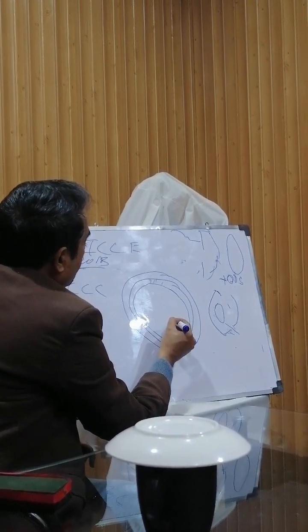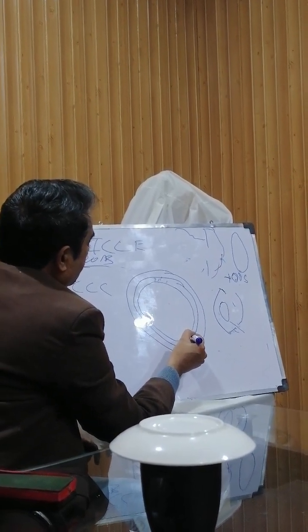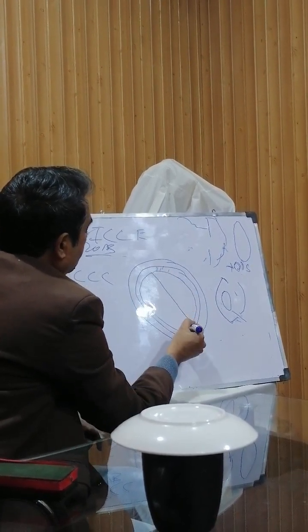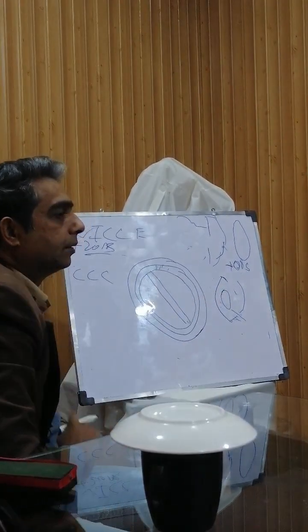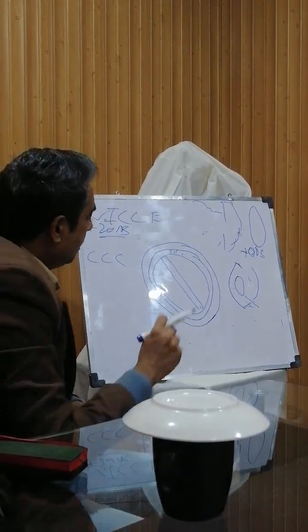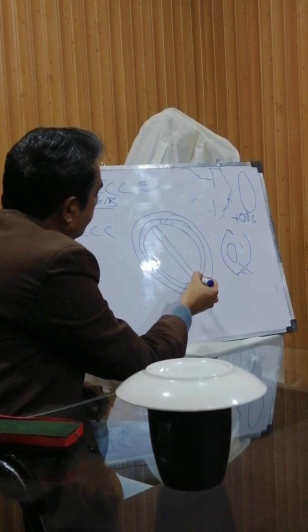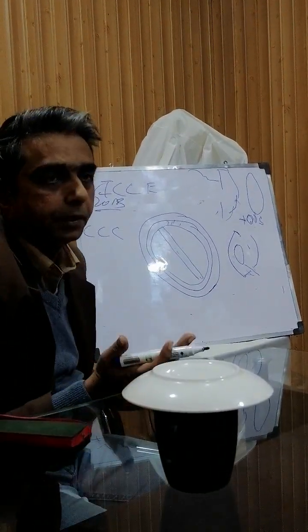After entering, what will we do after capsulorhexis? We will go to the memory one or step one, and we will eat away the whole part of the nucleus. Are you getting my point? When we press our foot, the probe will move into the cutting position, and we will put it over the nucleus, and it will eat away that part. It's very simple.